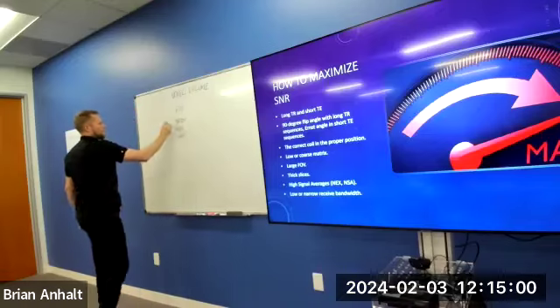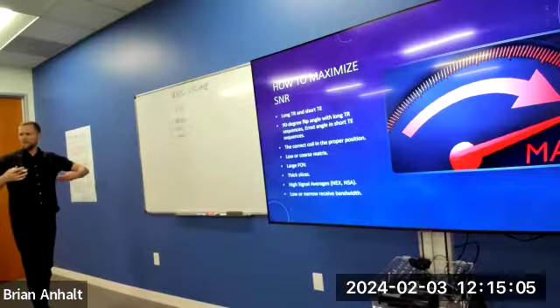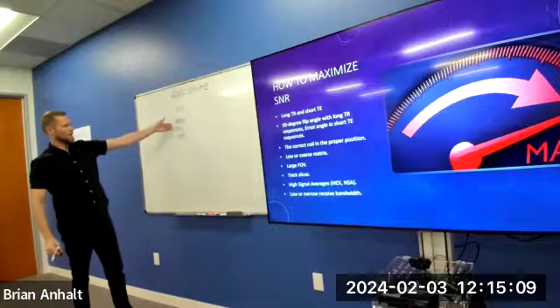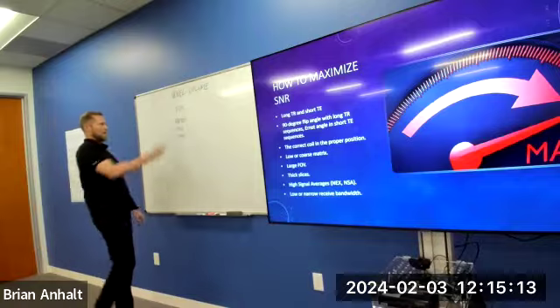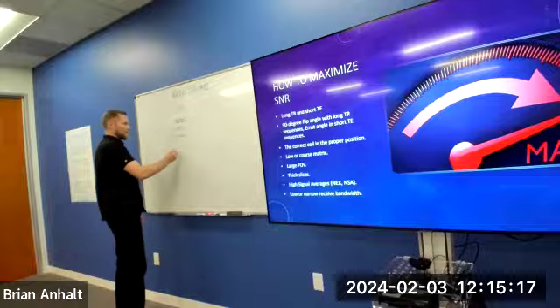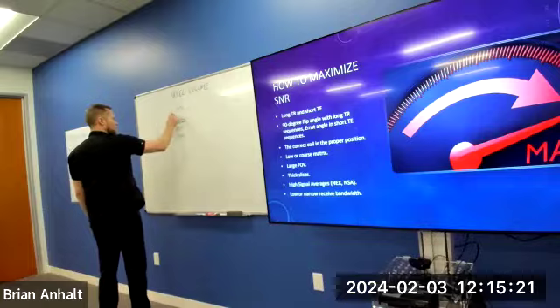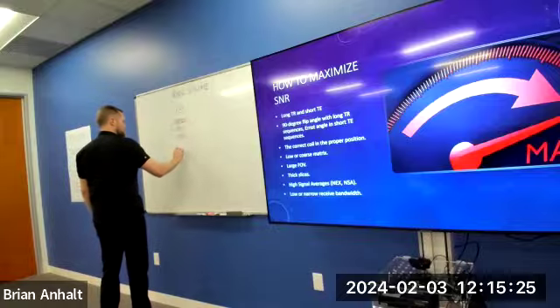So there are two different directions in our field of view, and we have to cut them into different pieces, and we can do an uneven matrix. We can do a larger frequency than a phase if we want, which we'll talk about in just a second. But we need to do our field of view divided by each one of these, multiplied together, and then what's the last parameter we're looking at for voxel volume? Slice thickness, right?